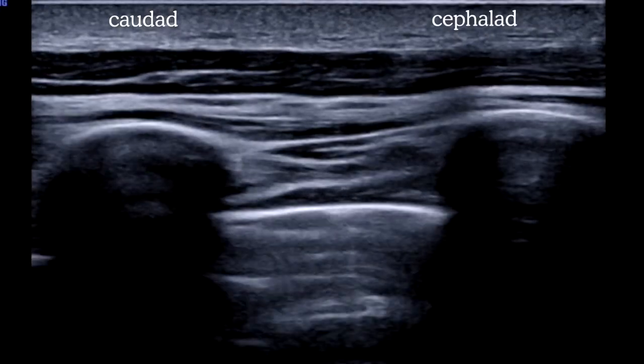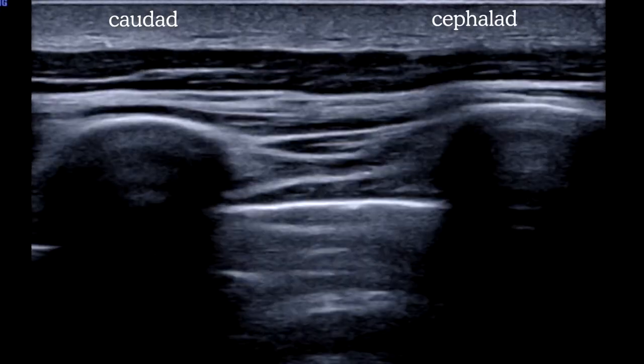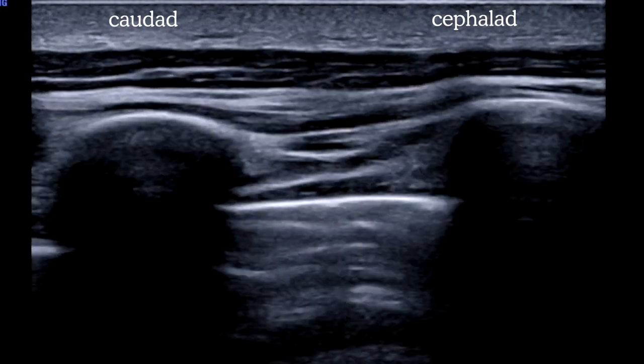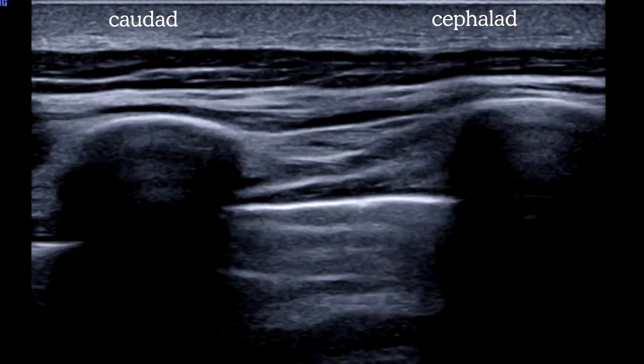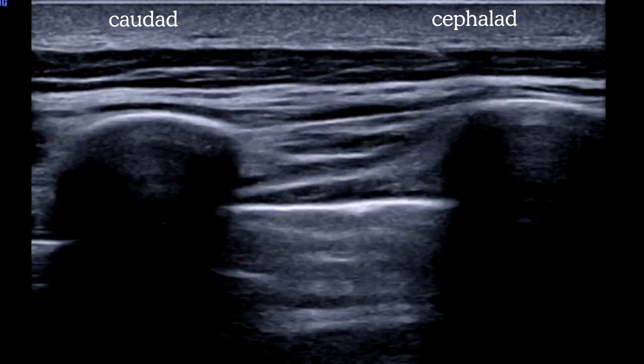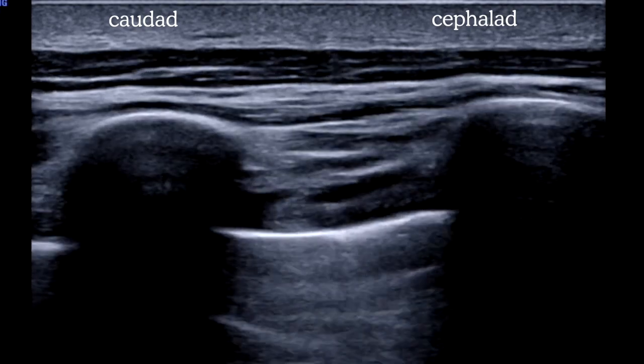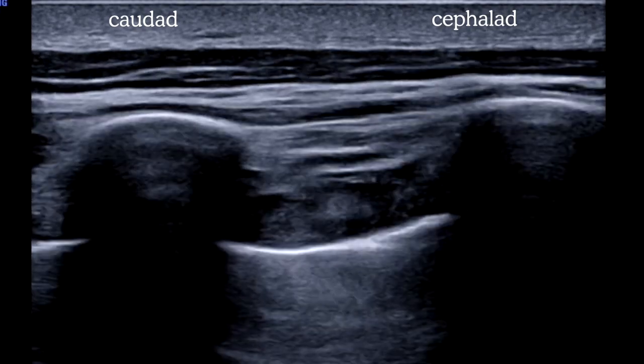I prefer the out-of-plane approach, which uses the same principles. Hydrolocate, advance, until you see that expansion above the pleura. It's a very safe method, and though you won't see your needle, the hydro keeps you safe. Oh man, that's sweet. Give your dose, and then move on.